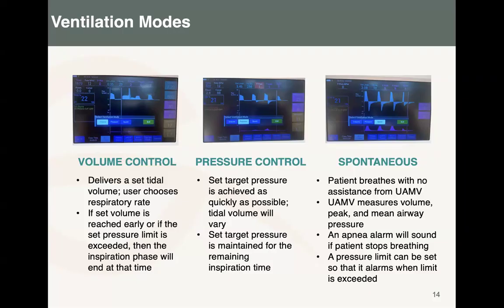On the other mode, the pressure control mode, the main parameter to set is the inspiratory pressure, which is going to generate your target tidal volume.